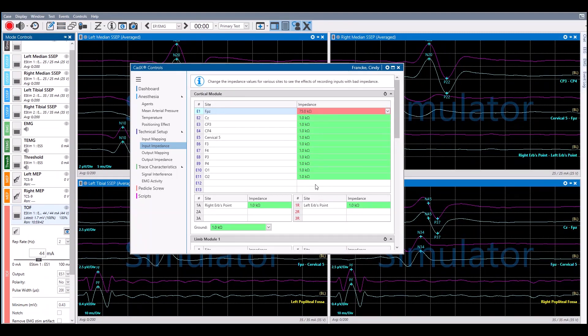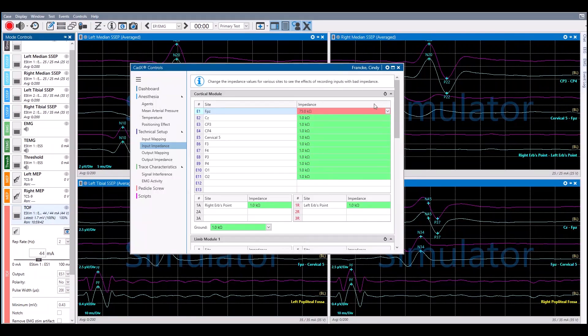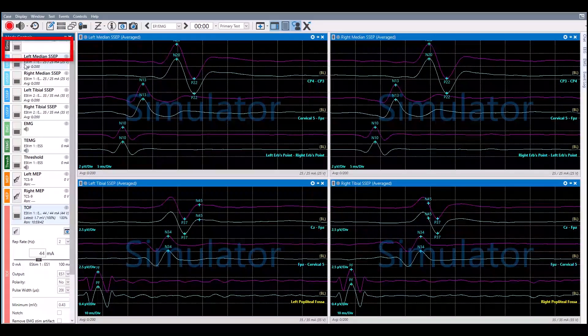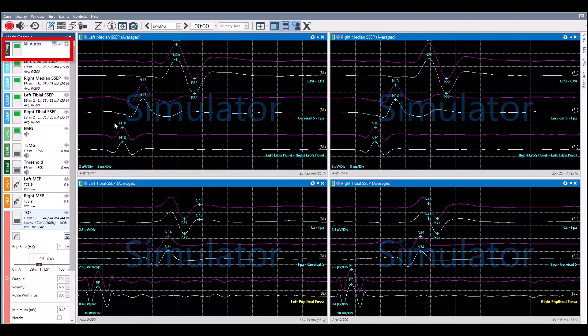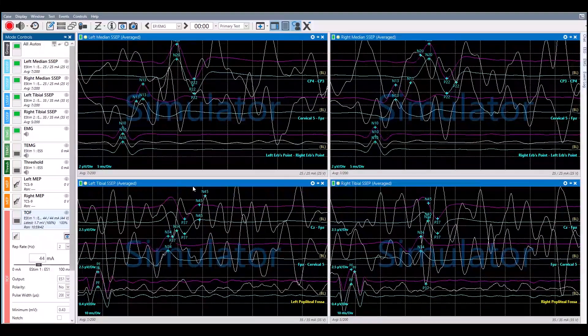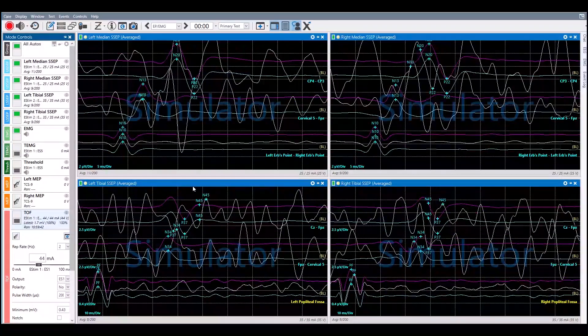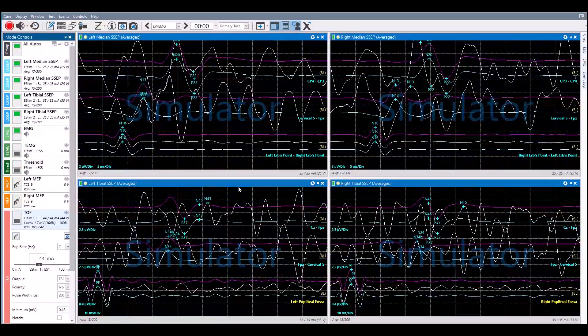The changes can be visualized on the mode or modes that the affected electrode is montaged into. In this instance, the modes are the somatosensory evoked potentials.